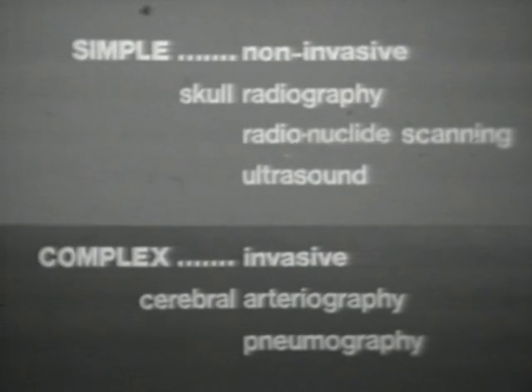Radioisotope scanning shows us where the administered isotope has collected in abnormal concentration, but again, it gives little indication of the anatomy existing within the cranium. Ultrasound shows by echolocation the position and form of interfaces within the brain. We may thus be able to say whether the midline or adjacent structures are displaced or deformed, or whether there are interfaces arising from abnormal conditions within a mass, such as a hematoma or a tumour. We again do not get a direct look at the soft tissue structures.